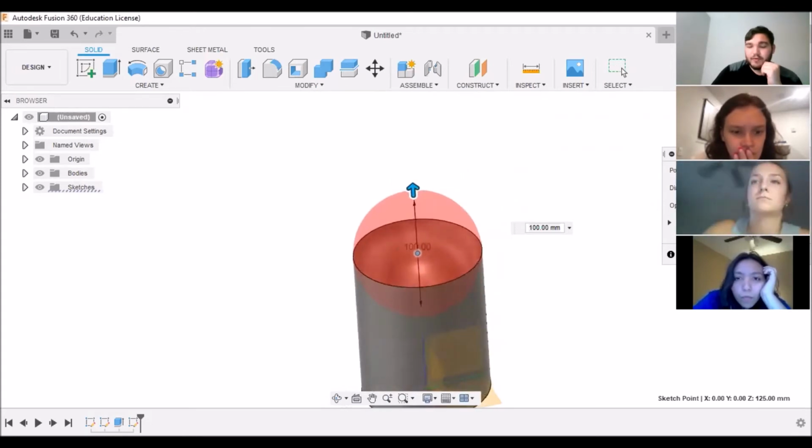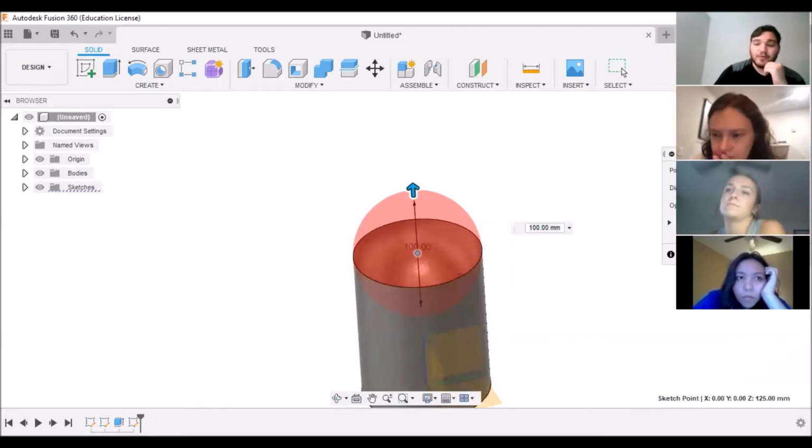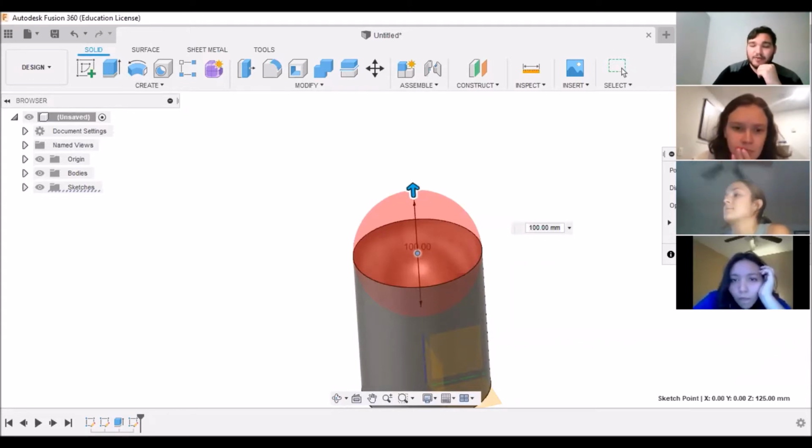Okay, so now we have to be careful. If we look at this little navigation tool on the right side, we have face, diameter, operation, and we can press OK. What do you think happens if we press OK right now?